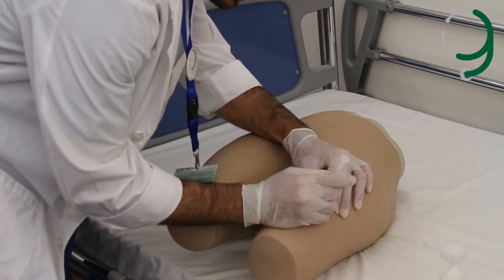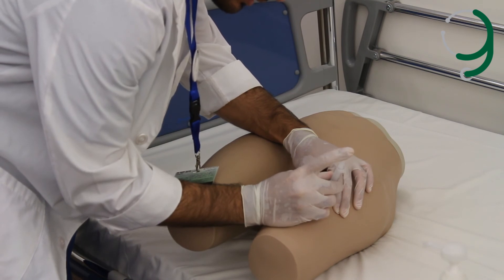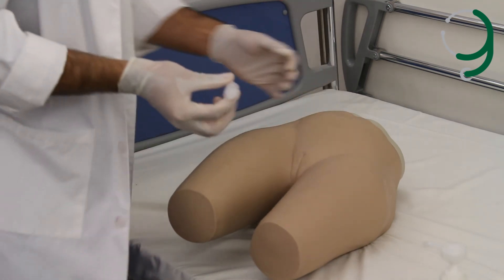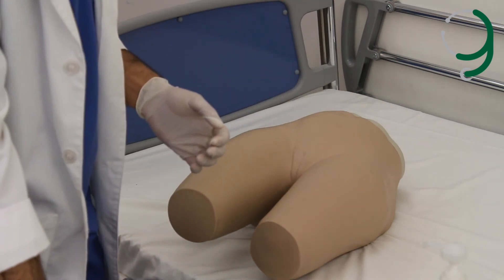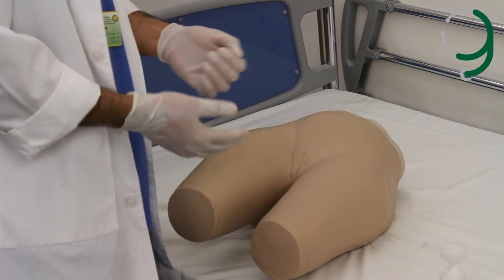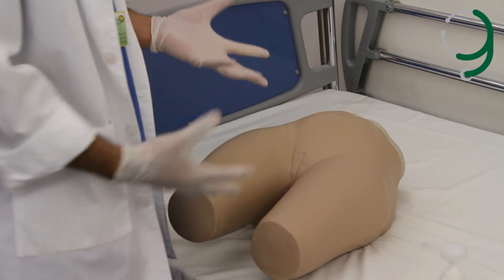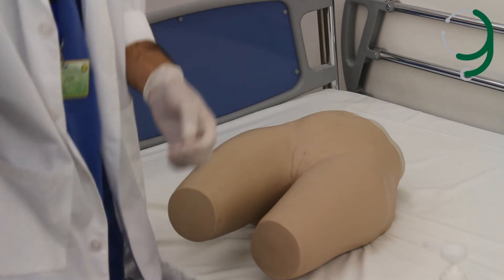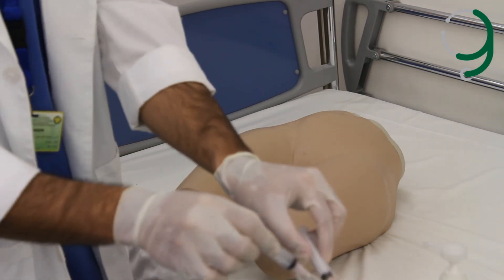We don't need to aspirate here — we inject directly. Then we release the skin and withdraw the needle, and wipe the area again. We don't need to put a plaster. Then we thank the patient: thank you very much for your cooperation. We discard all the needles and syringes in the sharps container.